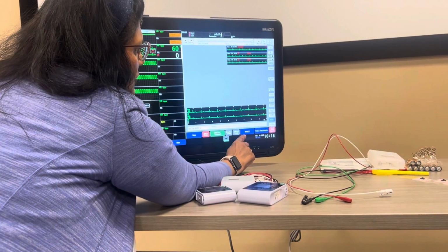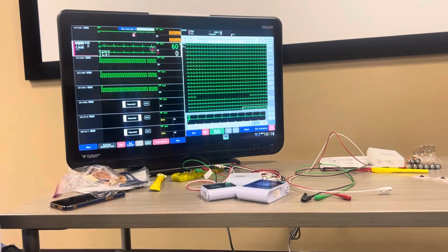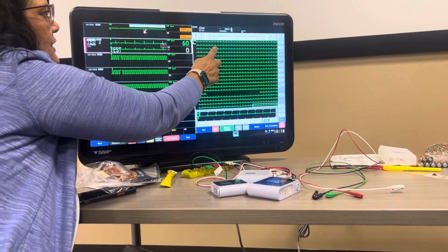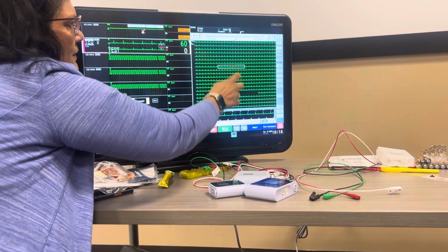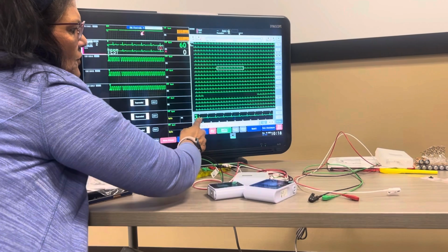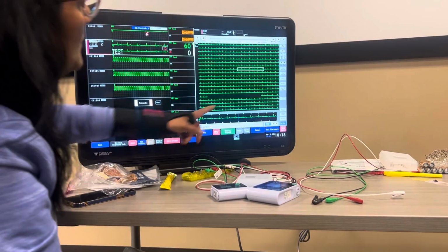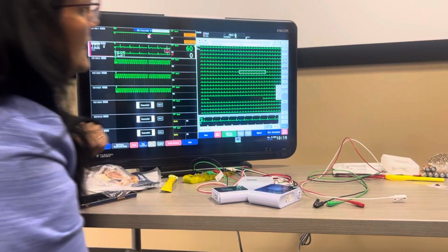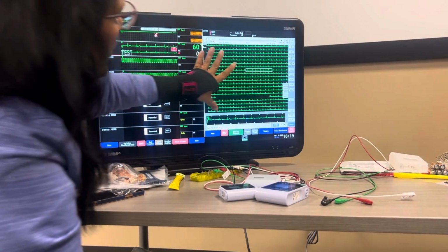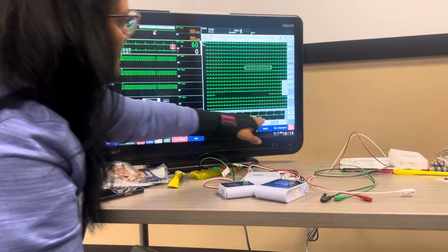So recall is all your alarmed events. Full disclosure is going to be your real time. Okay? And I can choose a little area. That's what's showing down here again. Or you could hold it down and move it if you wanted to do it that way. You can print here. Under print, there are a couple of different sections. Compressed is all of this, and then enlarged, you're just going to print that one that you chose.